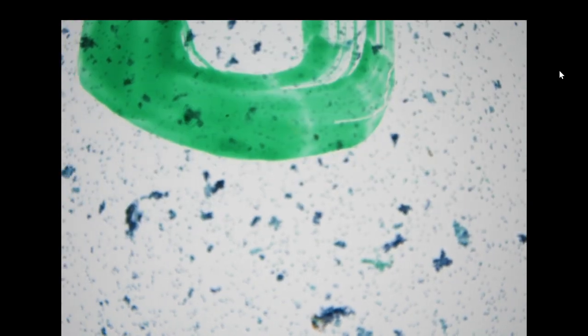The second case is also coming from urine, and this is not very common, but the case is very classic. This is coming from a 50-year-old male, and this is a washing urine cytology specimen coming from the right renal pelvis. Because it is a washing cytology, we expect to see a lot of cells in the specimen. So the cellularity is okay, it is adequate for our examination.